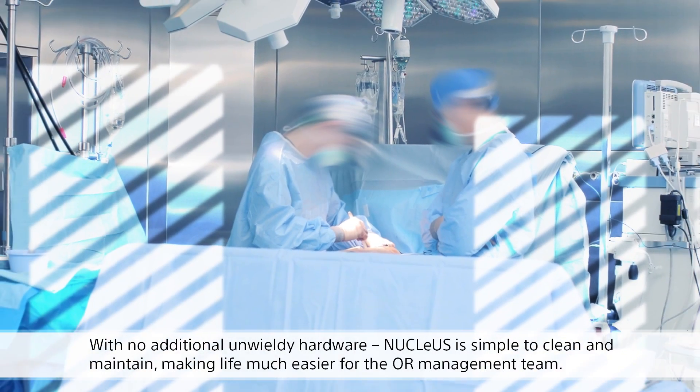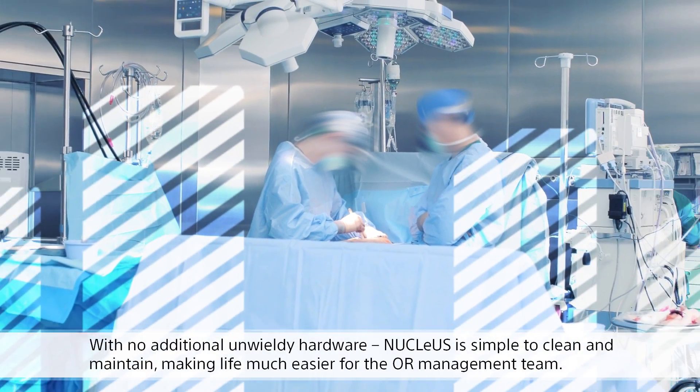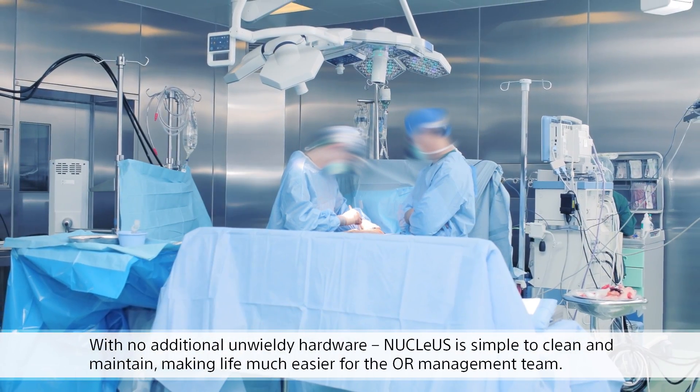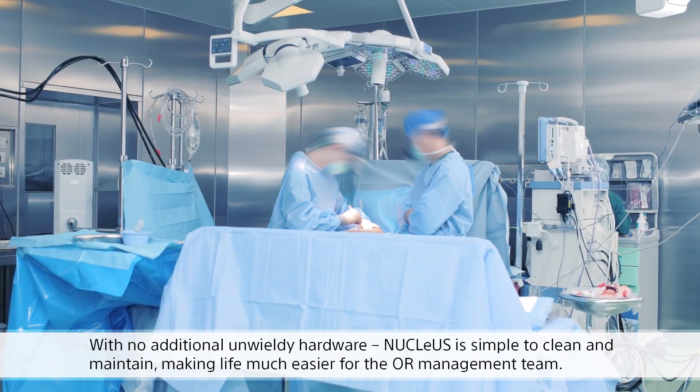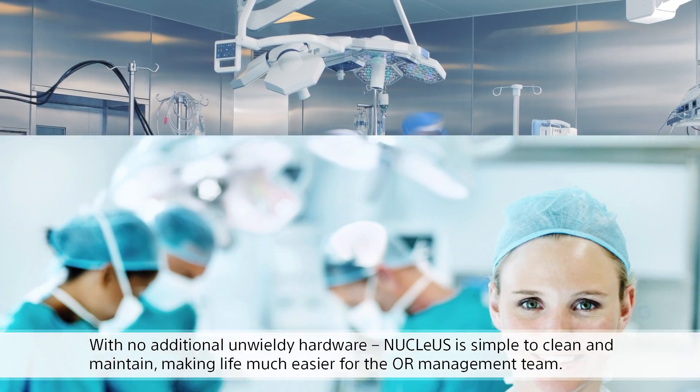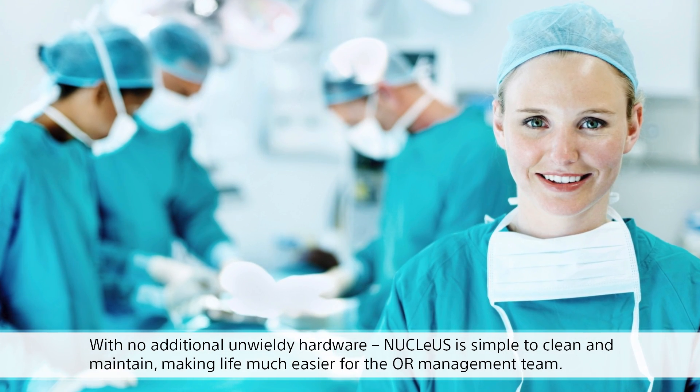With no additional unwieldy hardware, Nucleus is simple to clean and maintain, making life much easier for the OR management team.